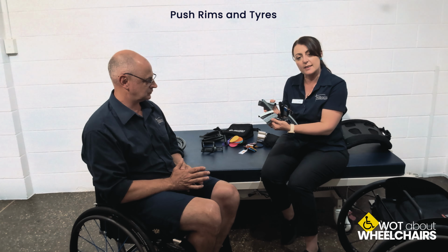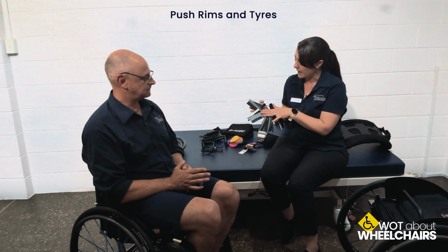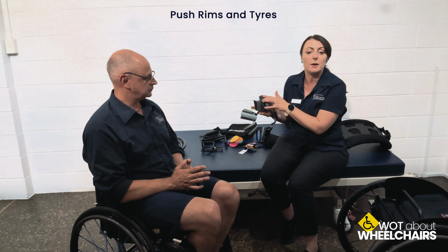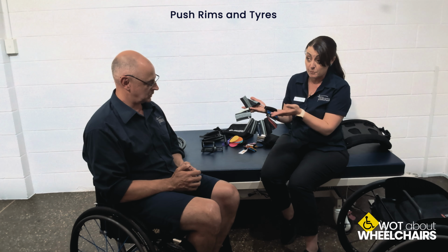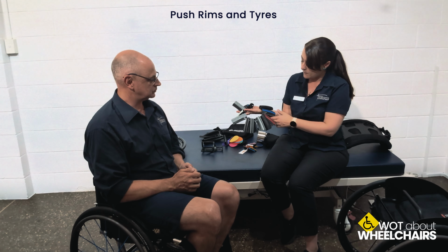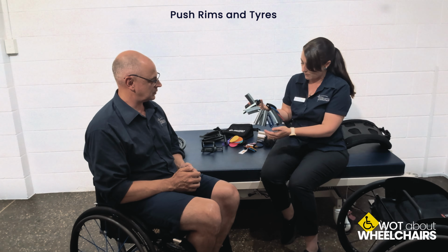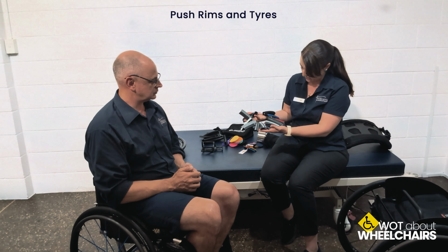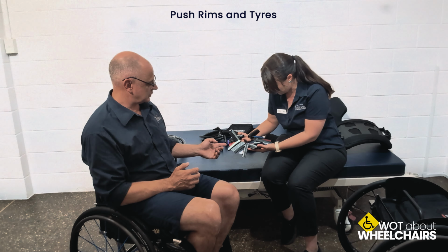So something like this would be super heavy duty if you're going over some uneven ground. But there's also different types of tread for grip on surfaces, if you're going over wet pavements or something like that. Then there are some where the tread actually goes in opposite directions. I'm just trying to see which one that is.